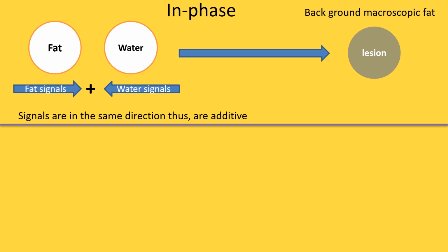These signals will be directed in the same direction, so the signal of this lesion becomes brighter and the signals are additive to each other.